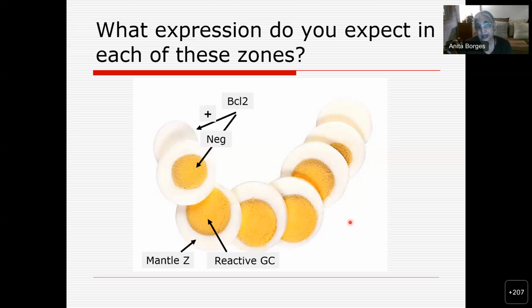And then you'll say, oh, there is a follicle here that is BCL2 positive, and God knows you might even call it an in situ follicular lymphoma. Now, that you should not do, because there's a reason why. You should remember that the ends of the follicles, when you are slicing it perpendicular to the surface, are going to have just mantle cells. And this is positive because it is composed of mantle cells.